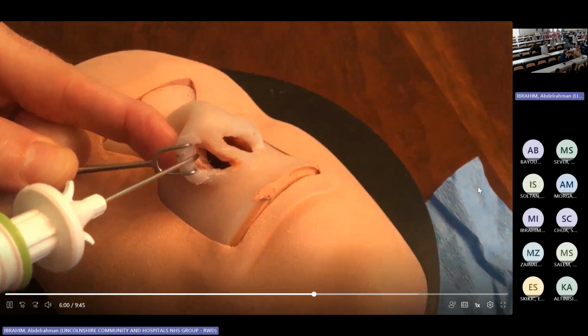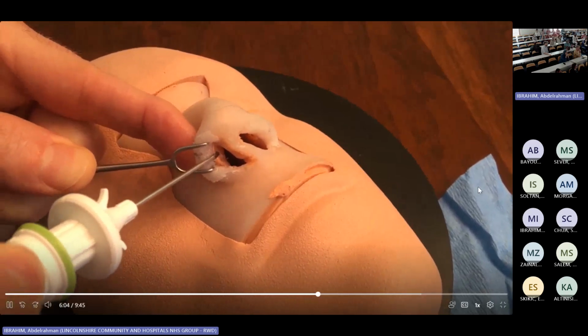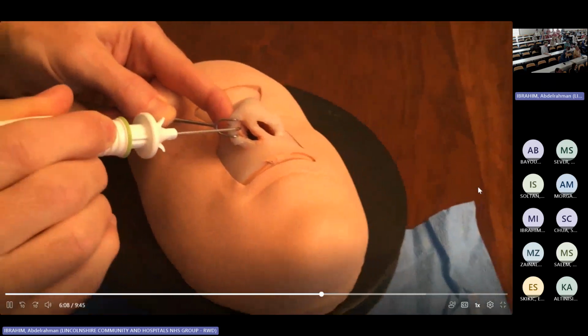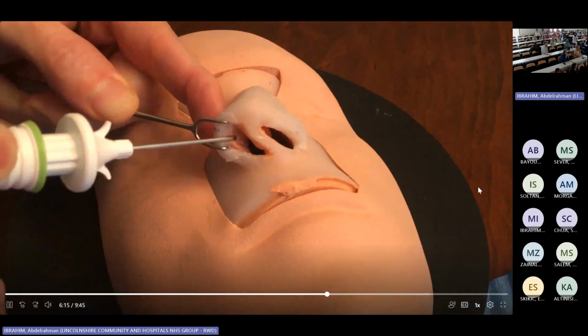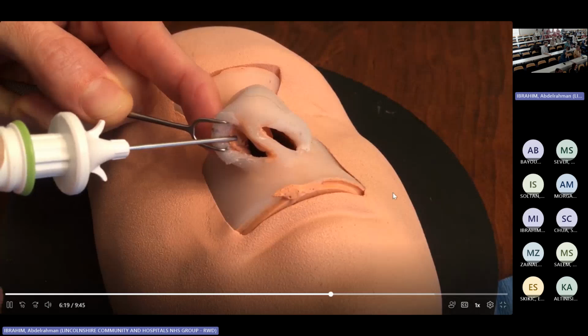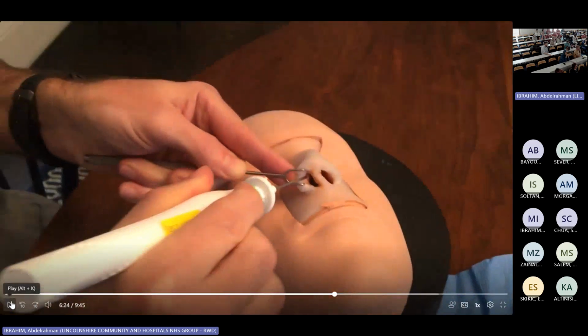So you're going to pierce perpendicular, almost 90 degrees to the septum. You can see the angle I have is towards the septum. So I'm going to pierce, and I'm going to pierce and plane thin to the vestibular lining. So you can see that bulge of the vestibular lining. So my bevel's disappeared a few millimeters. Make sure you're not passing the cartilage, okay? Because otherwise we'll be above the cartilage, and this is what we don't want.